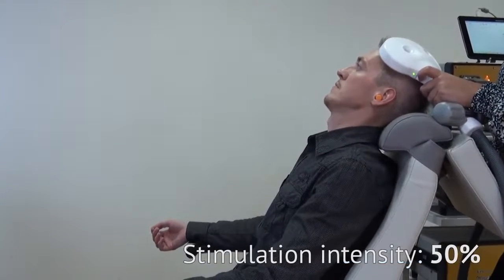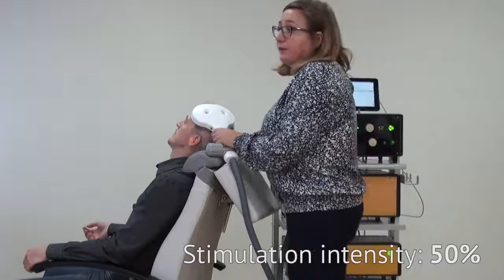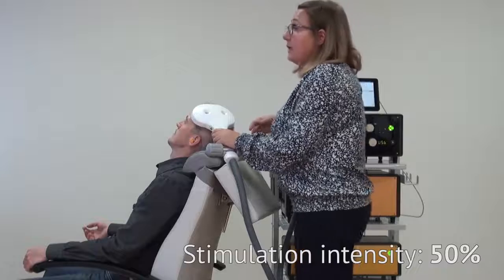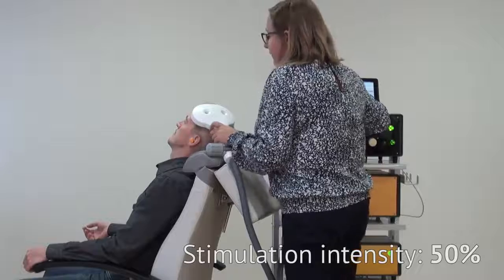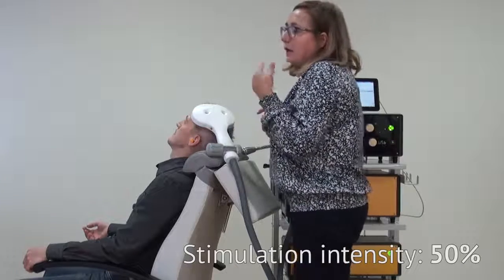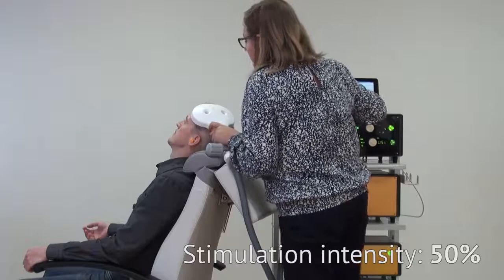Now I see the muscle contraction, and I need to find the point where stimulation with the same intensity will cause the maximum visible muscle contraction. To do this, move the coil about 2 centimeters around the reference point and observe muscle contraction.